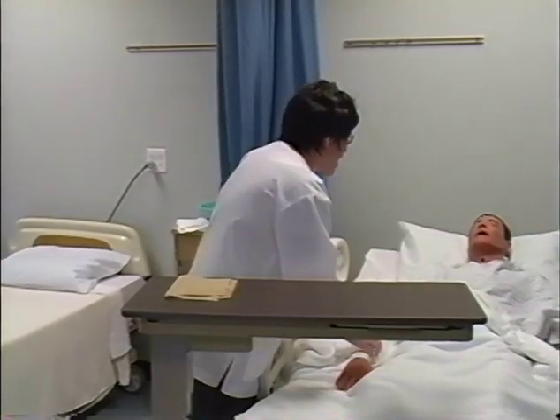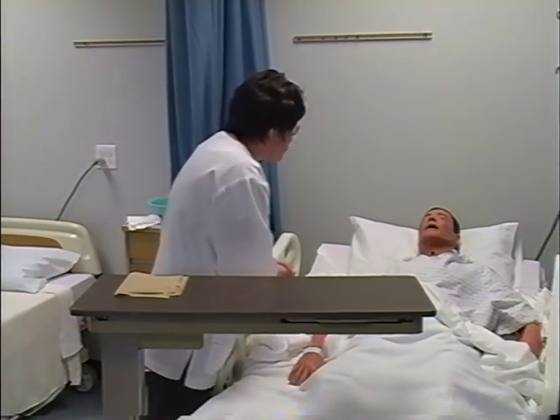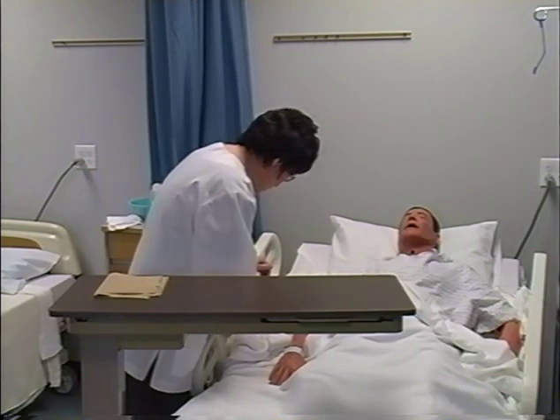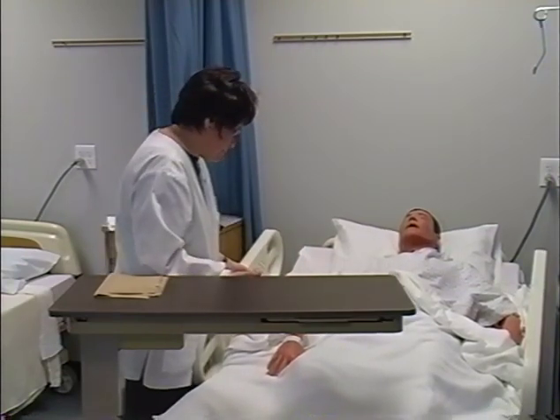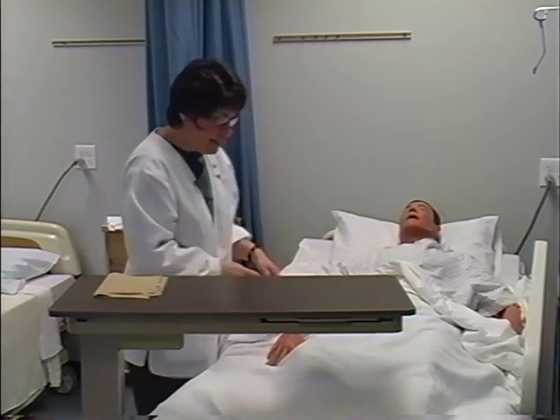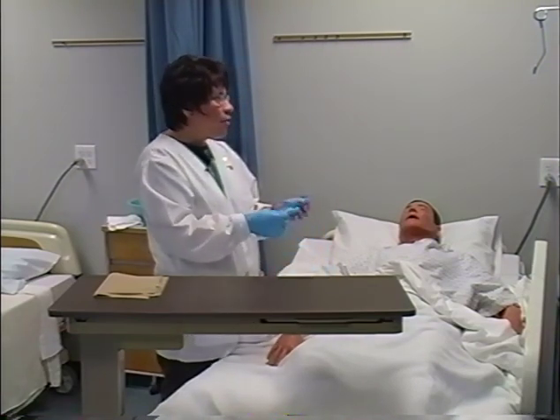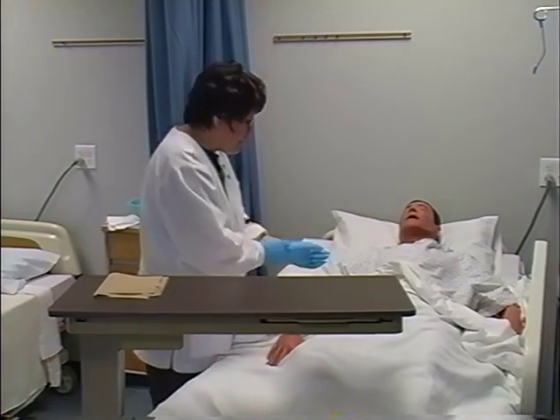Hello, Mrs. Lewis. My name is Beth Kroskopf, and I need to change your surgical dressing. Would that be alright with you? Before I begin, would you state your first name, middle initial, last name, and your date of birth? I'll check the identification band to be sure I have the correct patient. May I lower your head just a little bit so it'll be easier to change your dressing, and then I'm going to raise the head of your entire bed up. I have all my equipment gathered, I have excellent lighting, and I provided for privacy and the correct identification of my patient.